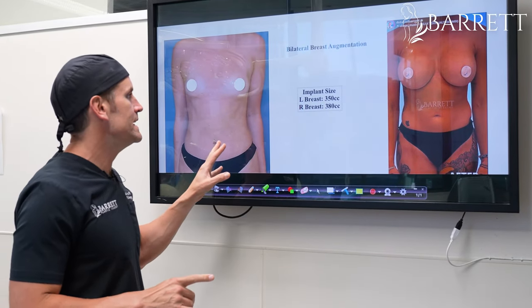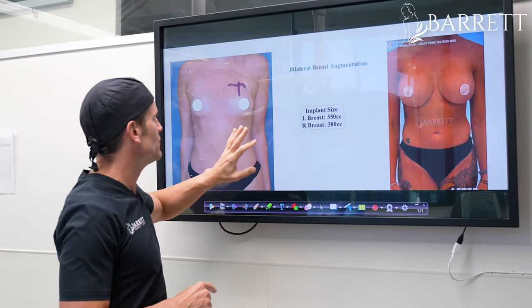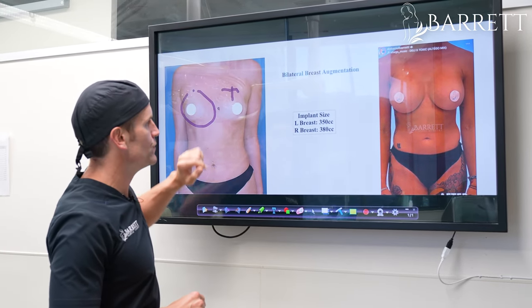Recap: we did an augmentation with differential sizing. Remember this breast was bigger than that one, so we tried a 350 over here. 375 and then 380 worked out perfect on this side.